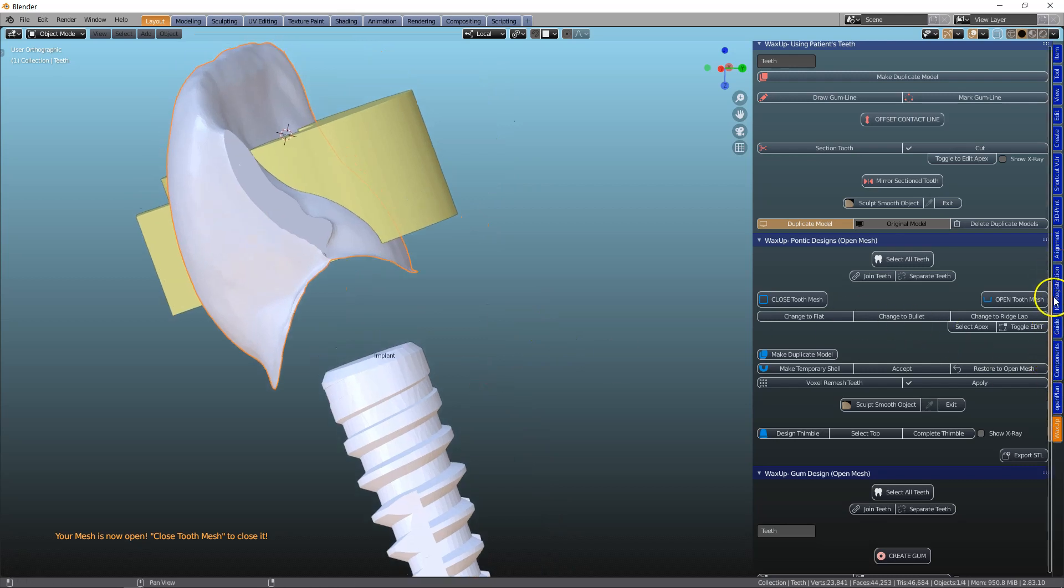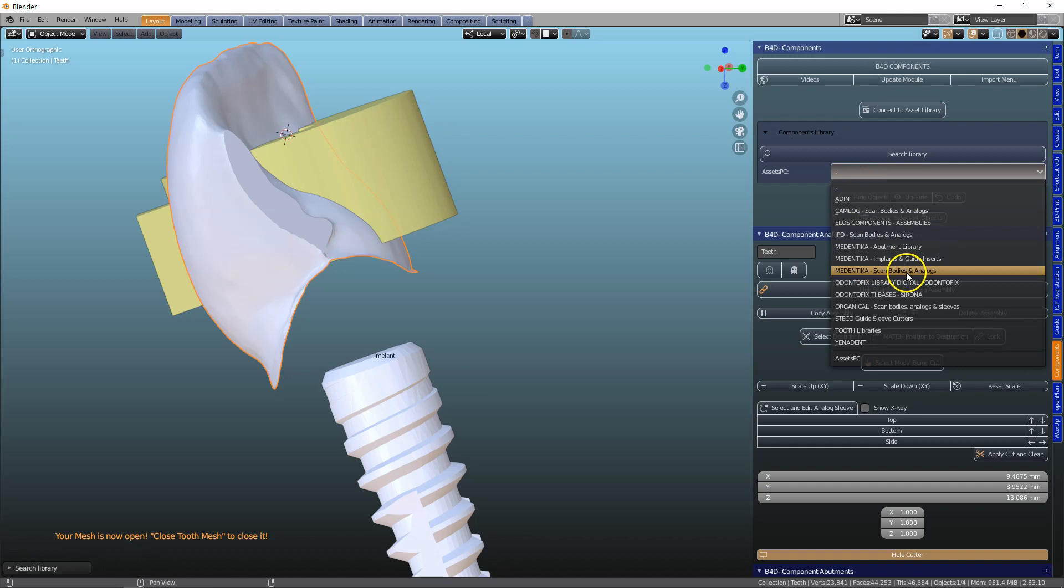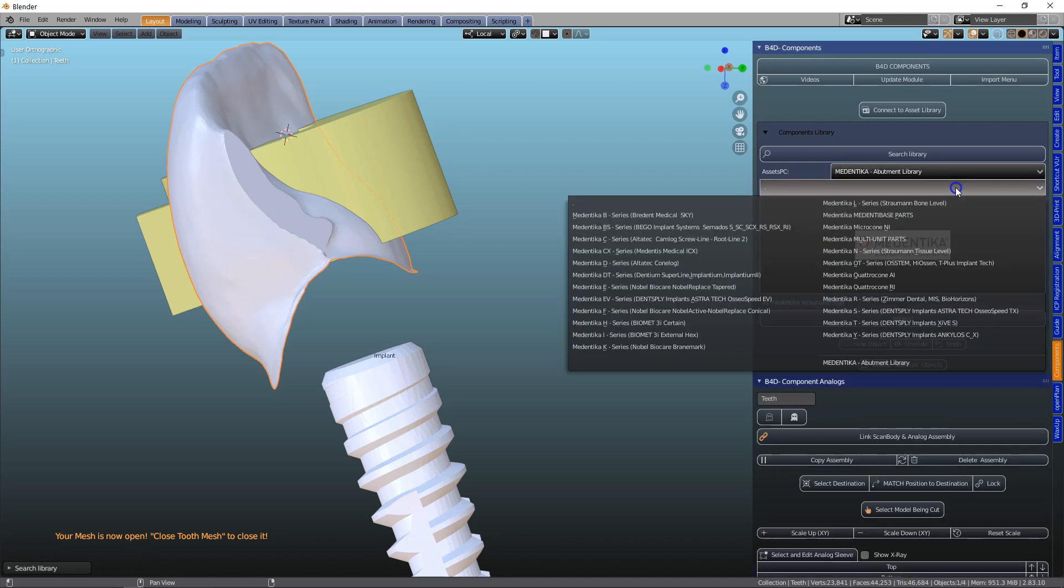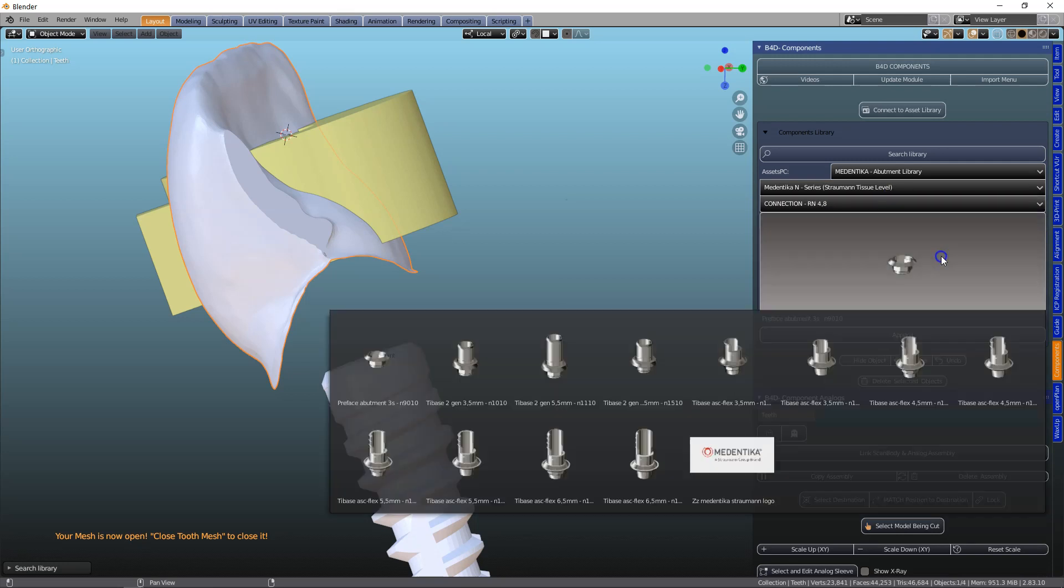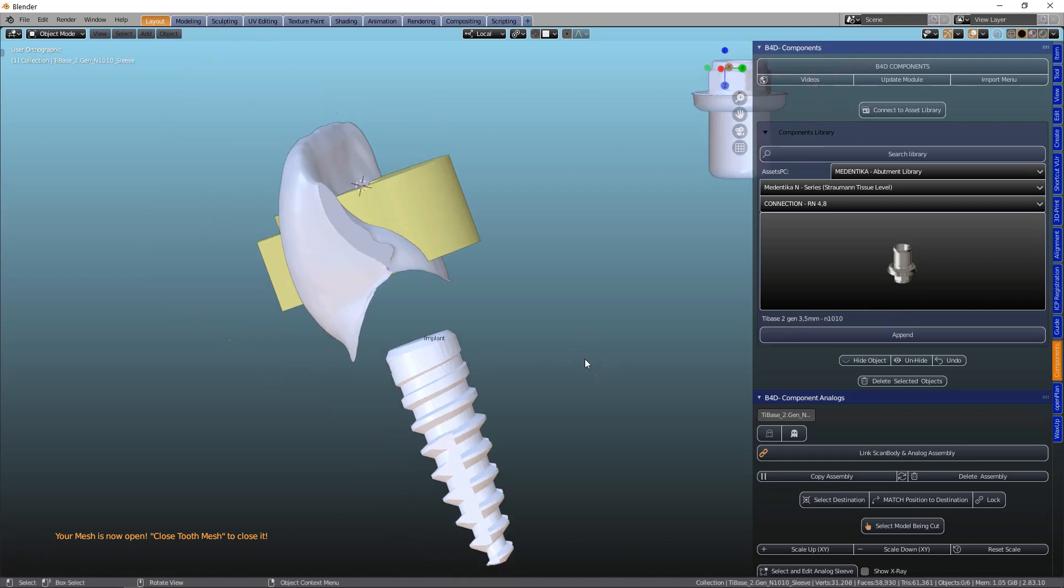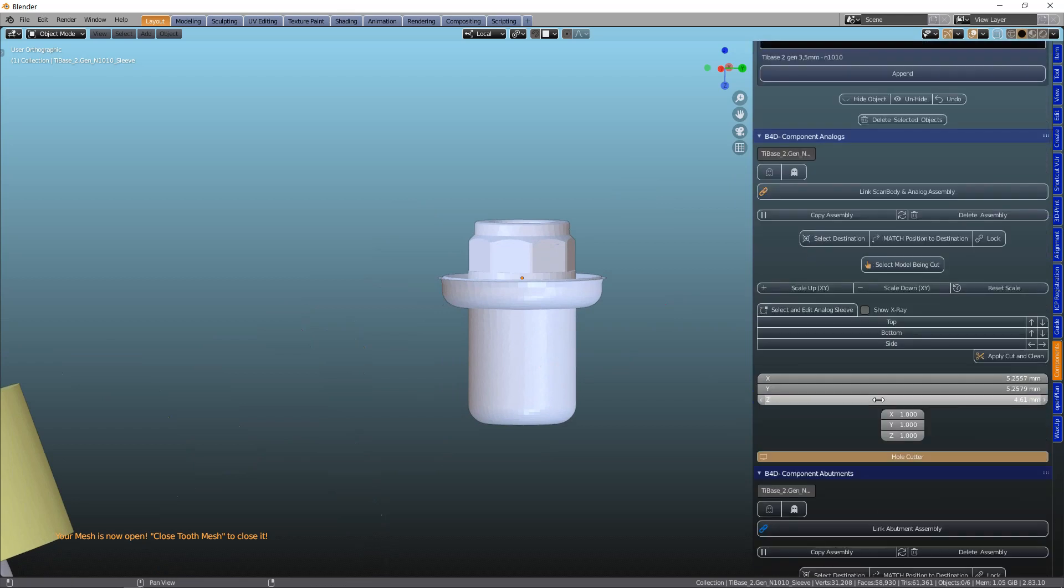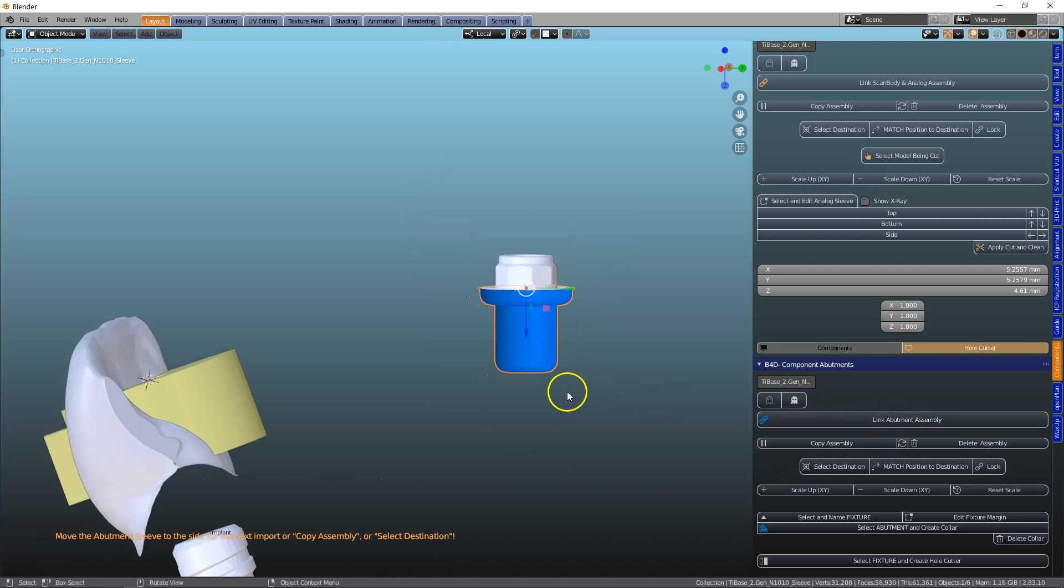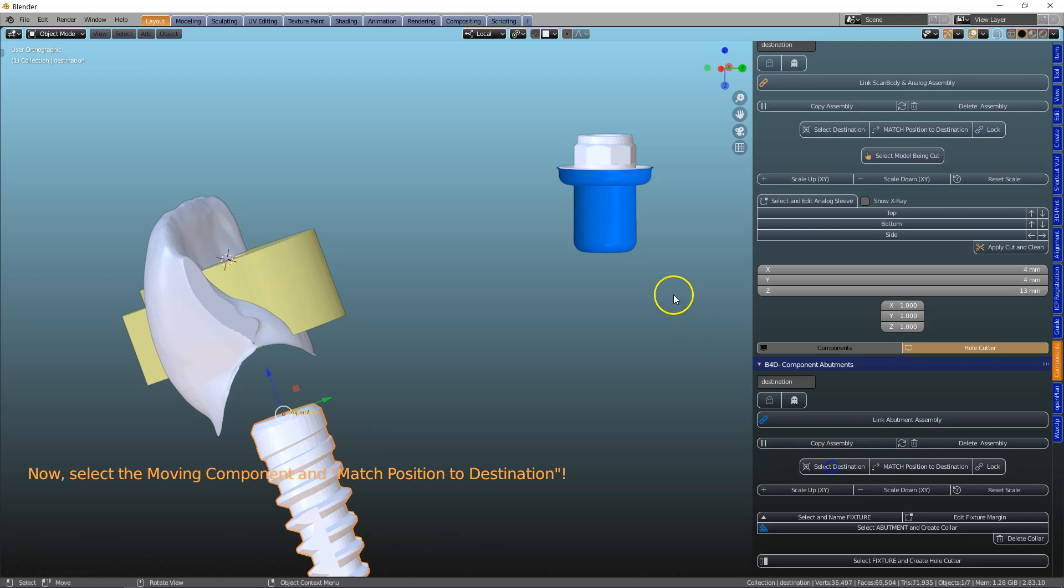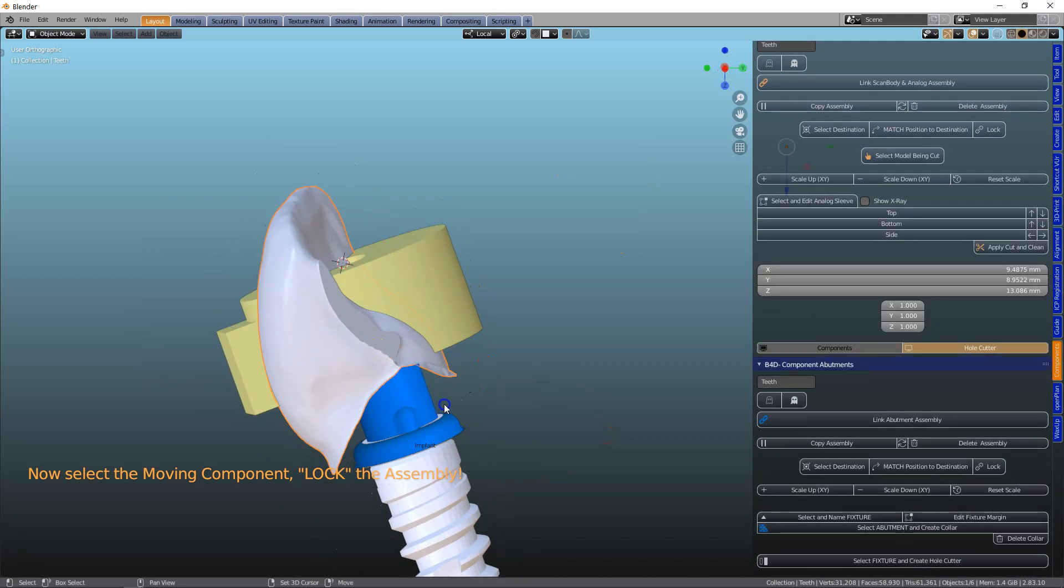Let's grab an abutment. So in the Components module, I'm going to be looking for say a Medentica abutment. Let's get a Straumann Implant 4.8 and append this into the scene. And then we're going to link all the components together in transparent mode. Something like that. And then we're going to snap this to our implant. This becomes our destination. And this one we're going to match its position. Then we're going to join the two up.